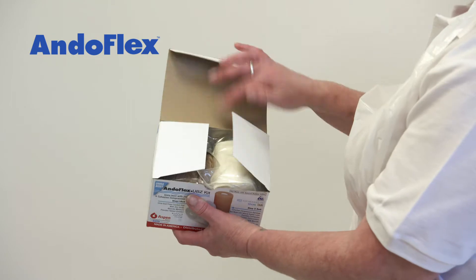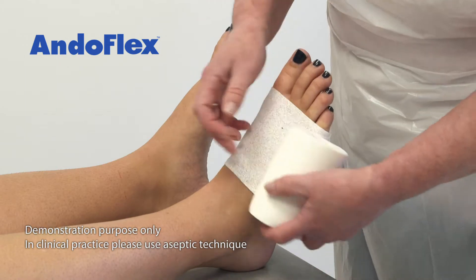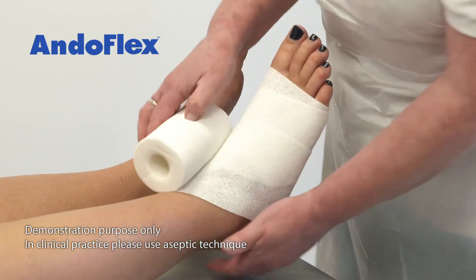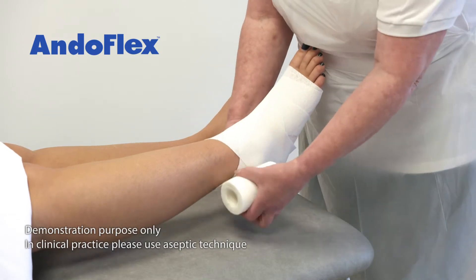Application is as simple as 1, 2, 3. Apply layer 1 starting at the base of the toes, winding behind the heel and continuing up the leg with a 50% overlap. The plantar surface of the heel can be covered or left exposed for patient comfort at the clinician's discretion.